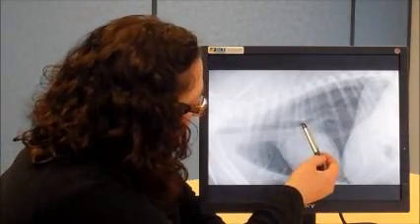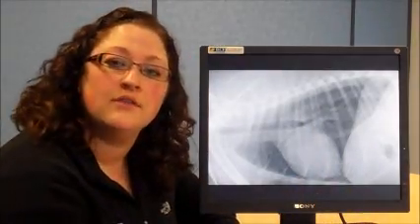Now I will demonstrate how to obtain a vertebral heart score. The first step is to obtain a very good quality lateral thoracic radiograph. This includes adequate collimation as well as an appropriate technique. The next thing is to determine the borders of the cardiac silhouette. The four points which are most important to evaluate are the ventral border of the carina, the apex of the heart, and the widest parts of the cardiac silhouette.